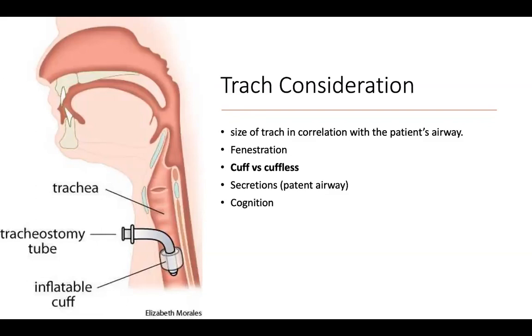When you put a speaking valve on, it's an in-between kind of thing. He's inhaling through the trach and exhaling through the mouth. So the voice shouldn't be that much different, but with some patients it does make a difference. The voice might not be as good as when you're occluding their trach. Okay.